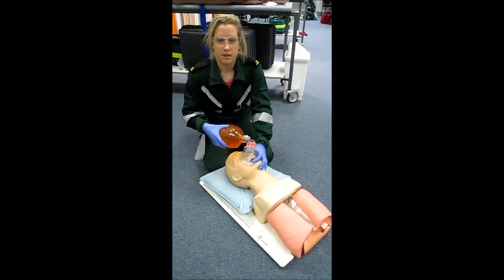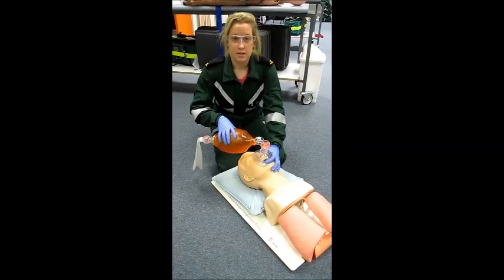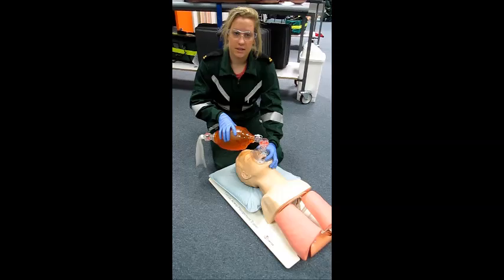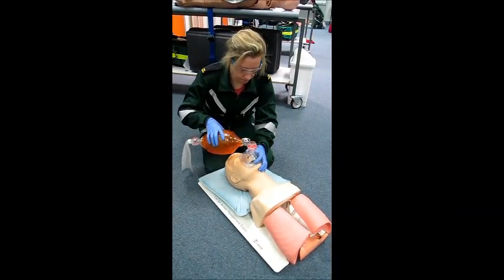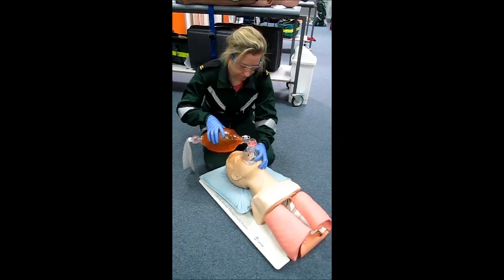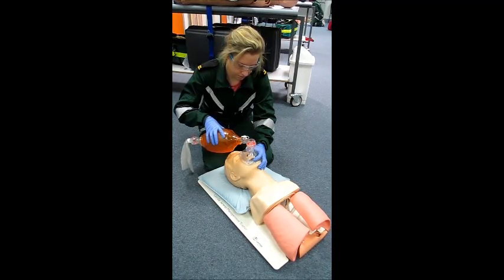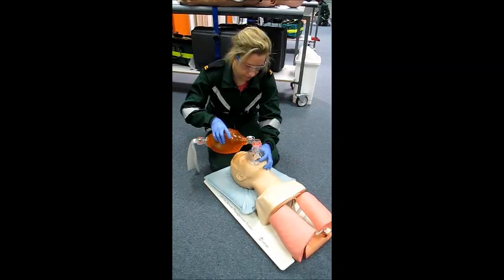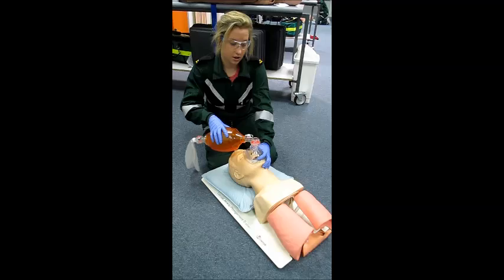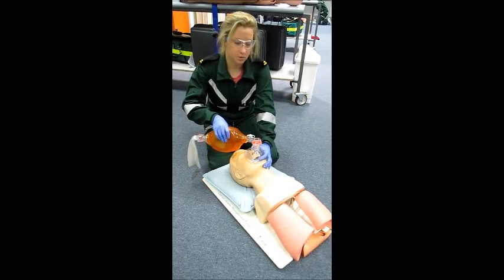Ventilate patients at 12 to 16 breaths per minute at 10 mls per kilo. For this patient we'll be depressing the bag about one third. I'll now demonstrate 15 seconds of assisted ventilation. During this time we'll be looking for rise and fall of the chest. A common error at this time is hyperventilating patients, which can be detrimental.